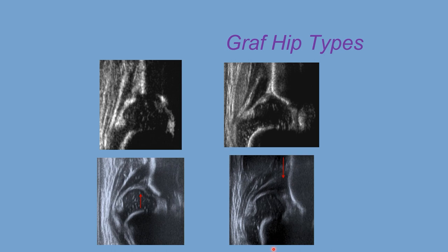Always complete your checklist before commenting on any type. For type 4, identifying the chondro-osseous border, femoral head, synovial fold, capsule — the labrum is difficult to see but is somewhere in this area — cartilaginous roof, bony roof. The turning point is difficult to find but is way below the labrum, and the roof is flat or even downward.